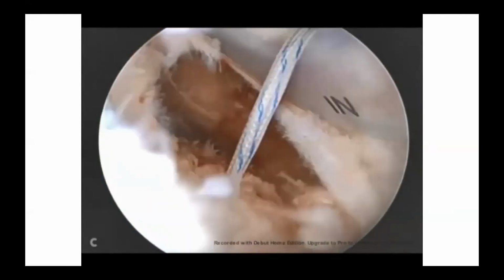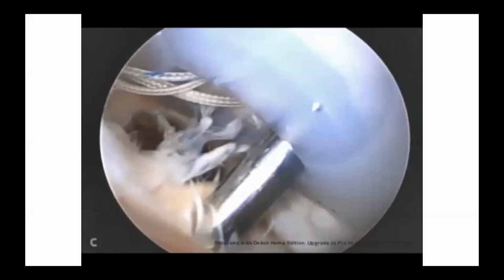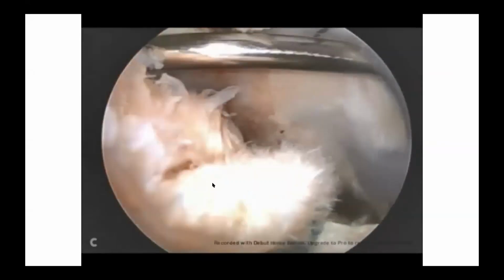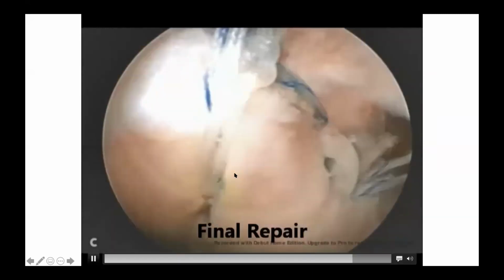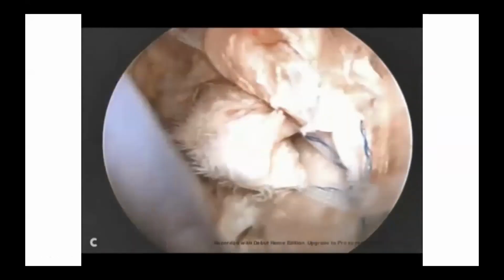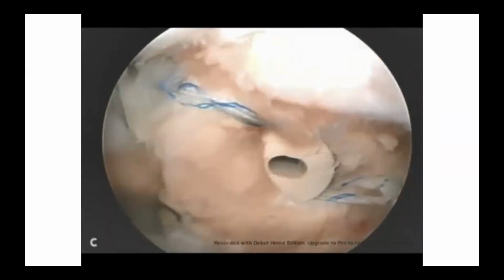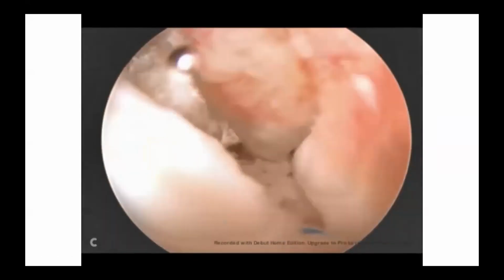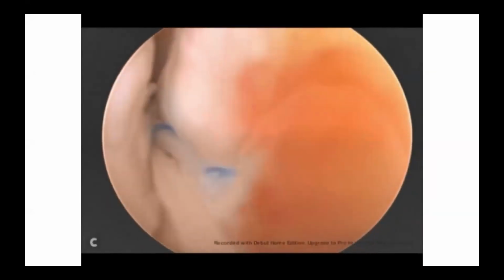One anterior, so the knotless anchor, with the medial and middle together into the lateral one. And this is the final concept, complete closure of the defect in a mattress fashion with complete closure of the cuff back to the footprint. This is from the bursal side, from the subacromial view, from the lateral aspect, and then going intra-articular to check that there is complete closure of the cuff back to the footprint.